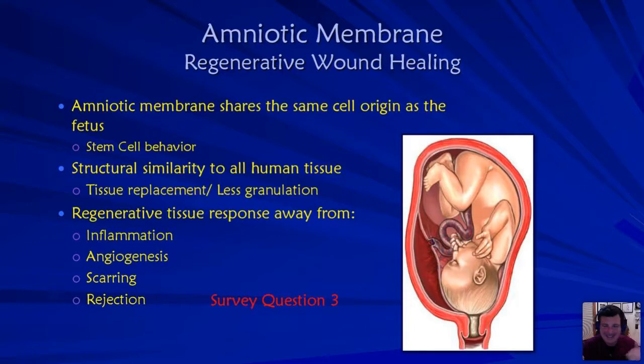These are planned C-sections. And when you get into the later slides here, you'll see that it's very highly tested and regulated tissue with blood work and lots of follow-up. So it comes from a planned C-section, and they're all human tissue. Sometimes I hear colleagues saying, well, I wonder if they use animal tissue. They do not. It's all human tissue.